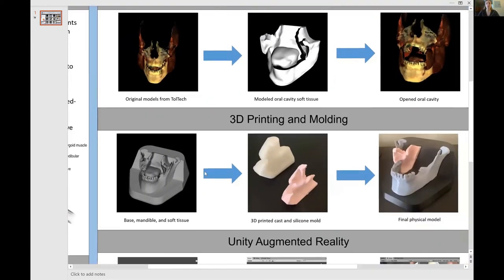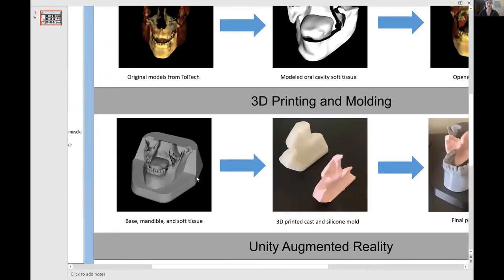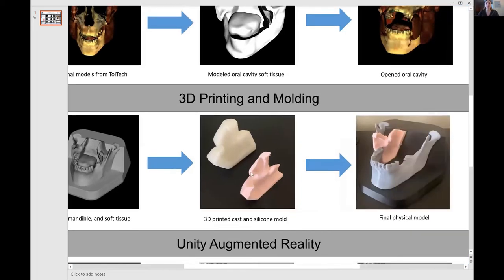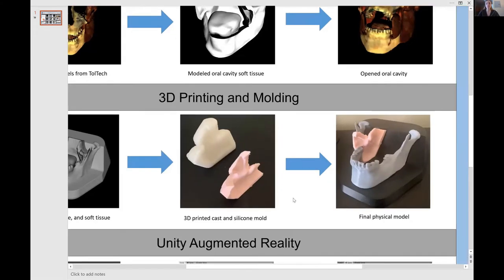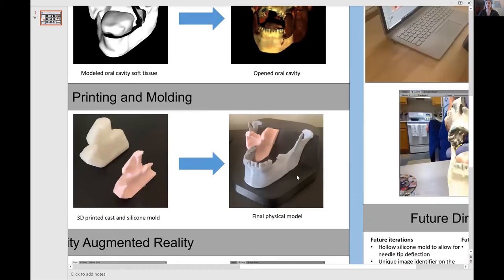The next step was 3D printing and molding. In Maya, we designed a base fitted with the mandible acquired from Touch of Life Technologies, and then the soft tissue model as well. In order to represent the density of the soft tissue as best as we could, we decided to silicone mold it. We have a 3D printed cast that was filled with silicone, giving us this silicone mold seen here in pink. Finally, all three physical models were fitted together: the 3D printed base, the 3D printed mandible, and the soft tissue cast.